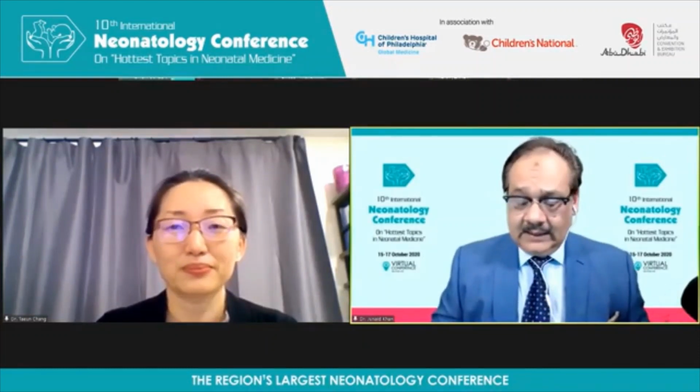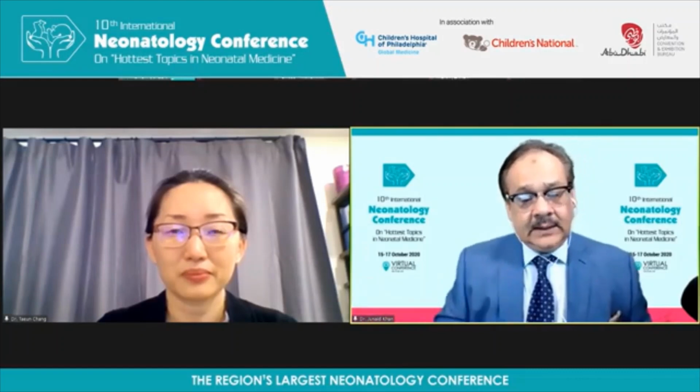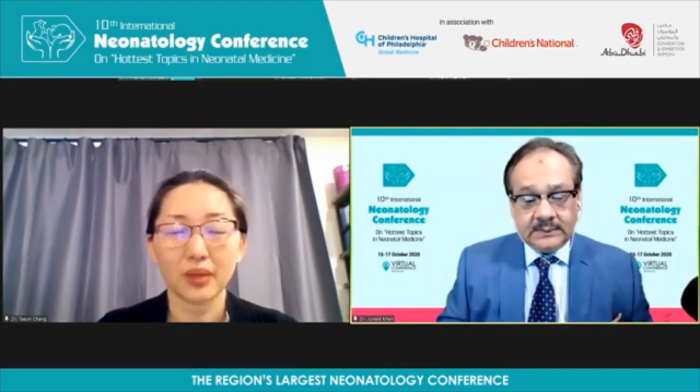Sure. Okay. There's a question about the follow-up, that the baby has some insult and it's grown out and there is no seizure now. Do you advise to have an EEG later in life when there is no active convulsion? So let's take, for example, a cooling baby that comes in, has seizures, and then we stop all our seizure medications by post-cooling, even if they were on 3 or 4 medications. But you know from both their EEG, because it's very epileptiform because of the acute injury, and their MRI, there is extensive injury. Those are the kids that it is useful.